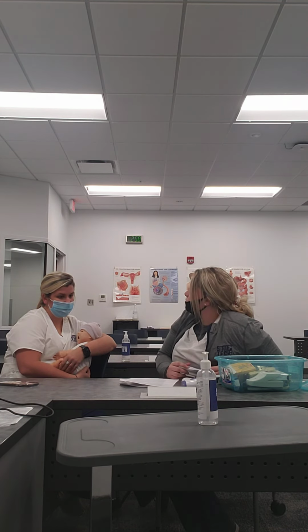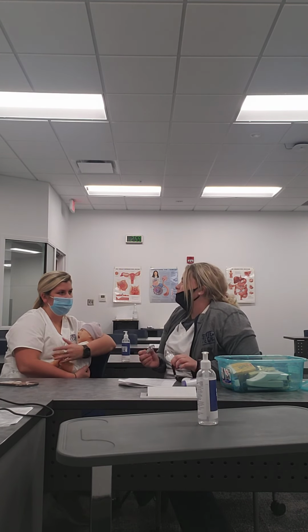However, wait until your baby's at least 6 months old to use the tympanic, the ear one. So you don't want to use that one just yet. Okay. Is that just because of the development of the ear? Yeah. Okay. And then they also suggest, when in doubt, if you get a weird reading, let's say you have the temporal and the digital, go ahead and take a rectal. Okay. I know a lot of people are uncomfortable, but yeah.